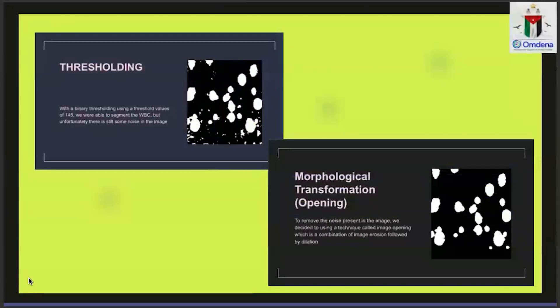After extracting the alpha channel, we discovered there was some noise. To remove this noise, we decided to apply a morphological transformation called opening. What opening does is it first erodes, then dilates. During the process of erosion it totally isolates the noise, then dilates so that we can restore the structure of the cells to their normal shape.